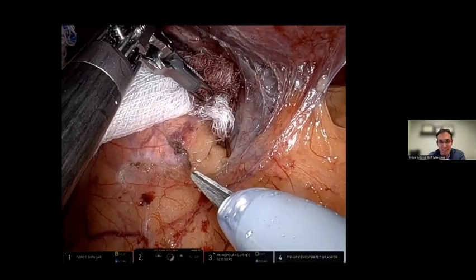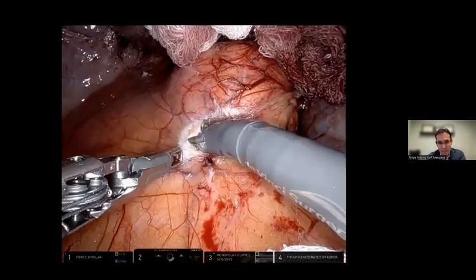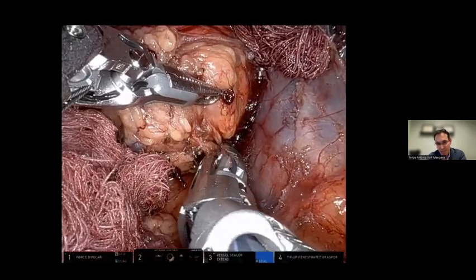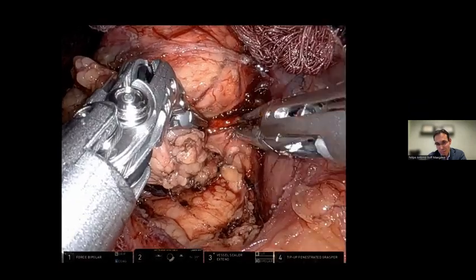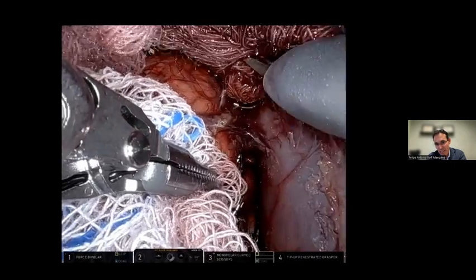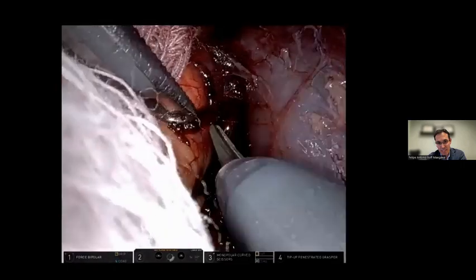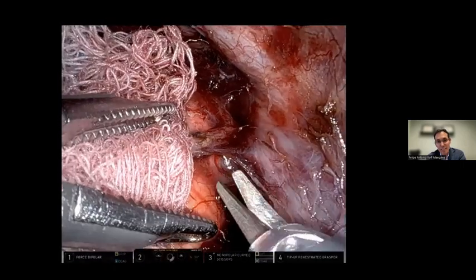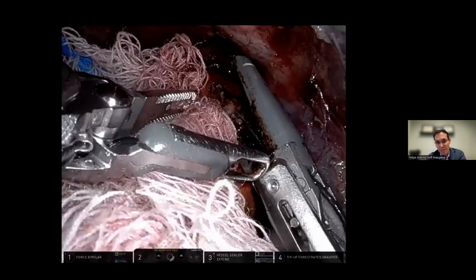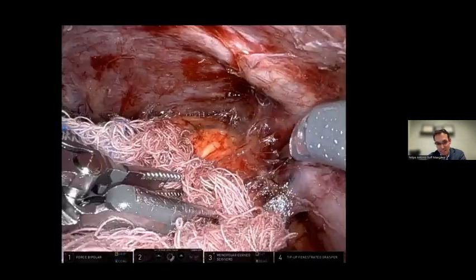So we free the gland circumferentially off of the IVC so you can have a good exposure of the inferior vena cava in case you have to do any suturing or any stapling to control bleeding. So we mobilize inferior medially with the vessel sealer, then we go back to our site of bleeding. We remove the pressure gently, and the bleeding by that time is already stopped. You can see there is a very small branch of the vein under that artery that was the source of bleeding. Go around with the scissors, control with the vessel sealer, and we're back to business.